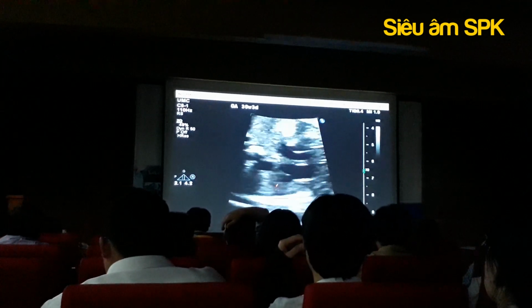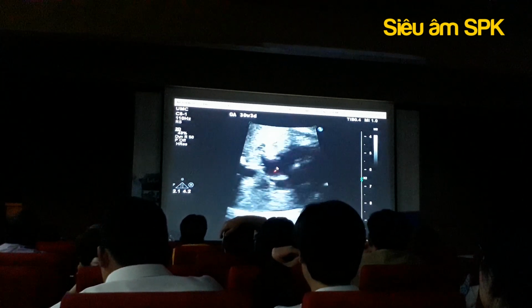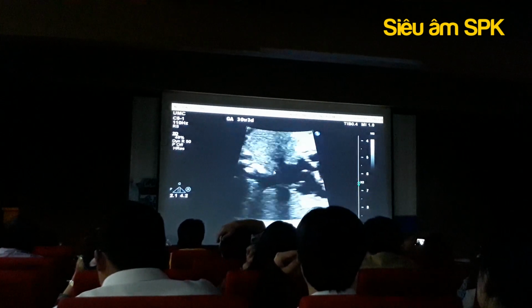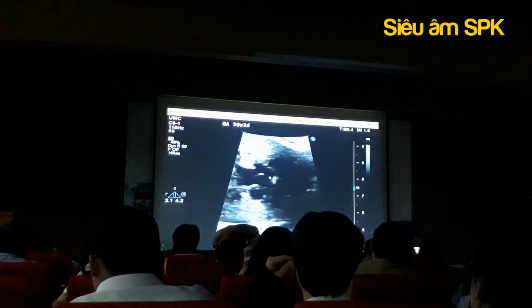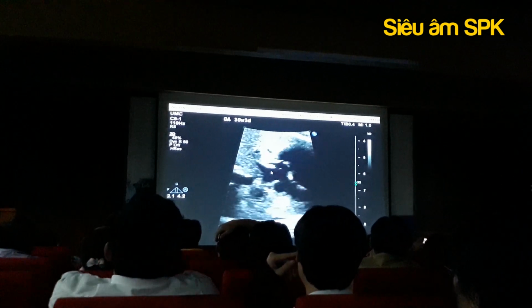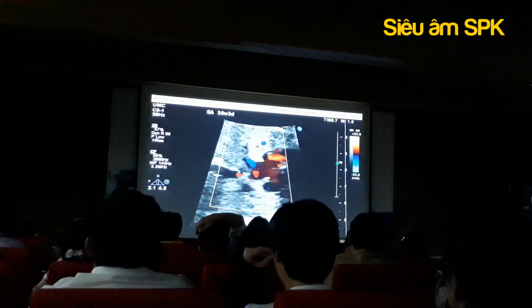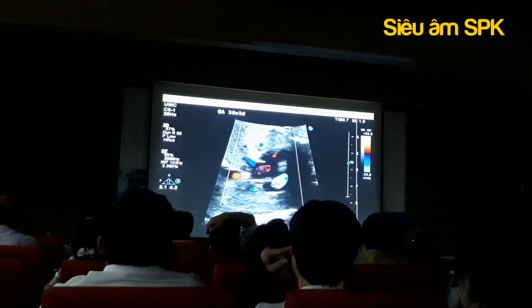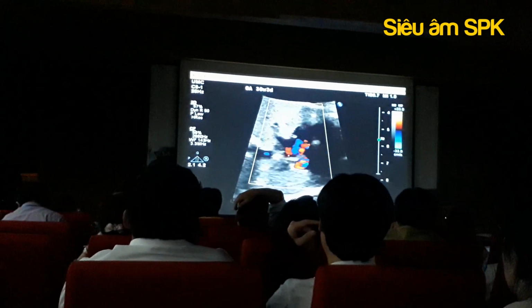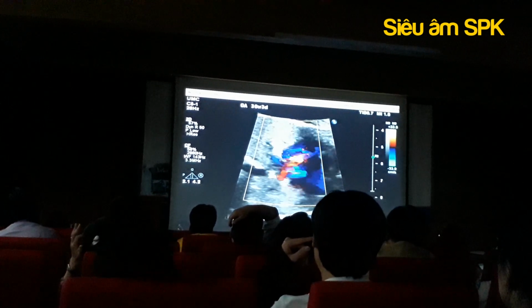So. There's the other pulmonary vein, right.